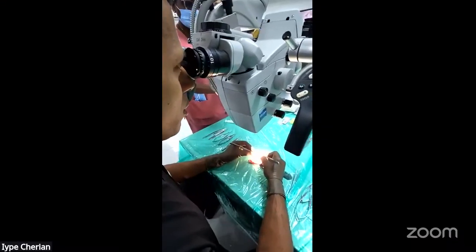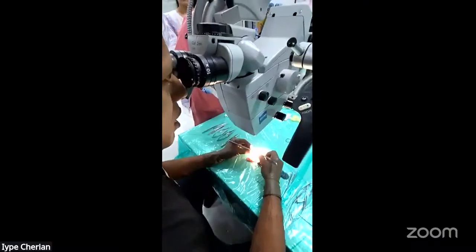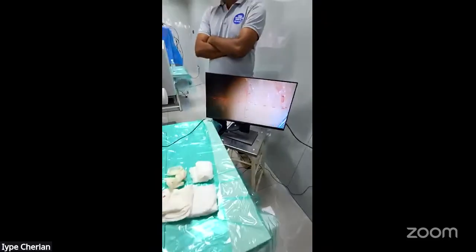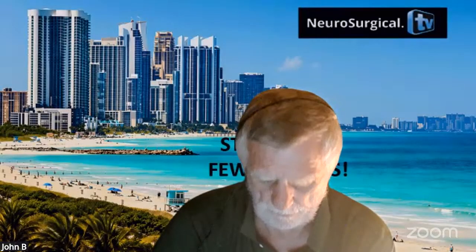Yeah, I have a question. So, John, that particular camera, can you go over a cadaver with that camera? Can you just show the field, please?